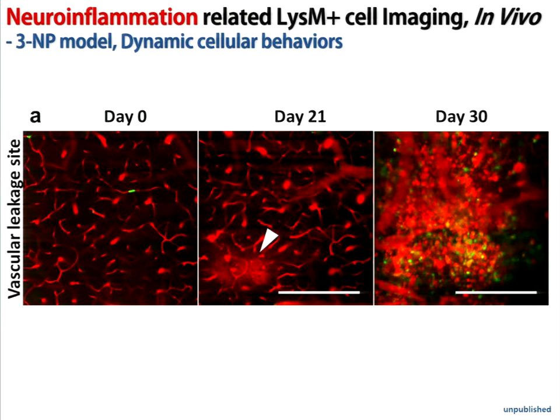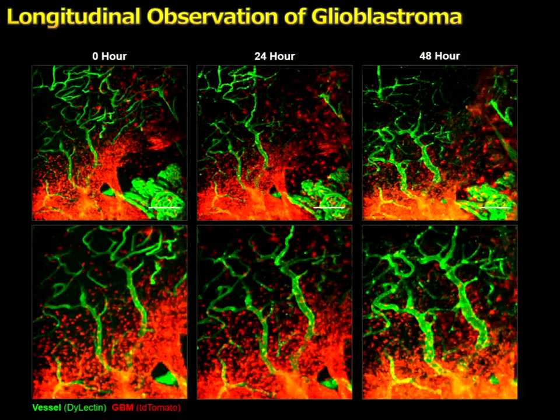So again, these temporal changes in the same tissue in the live animal model can be effectively investigated by using intravital microscopy techniques.